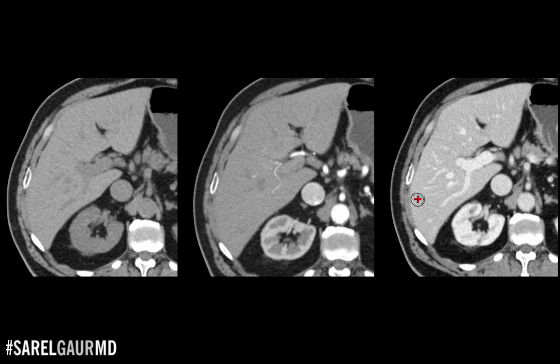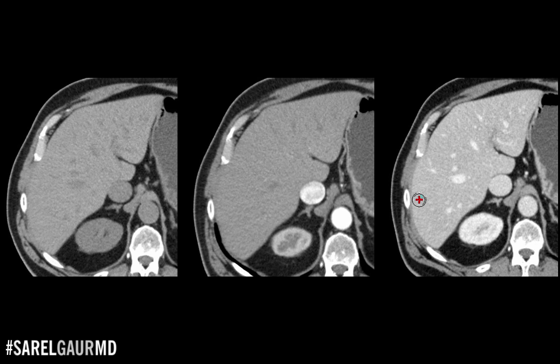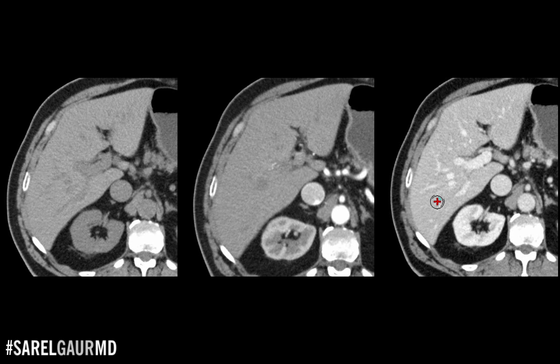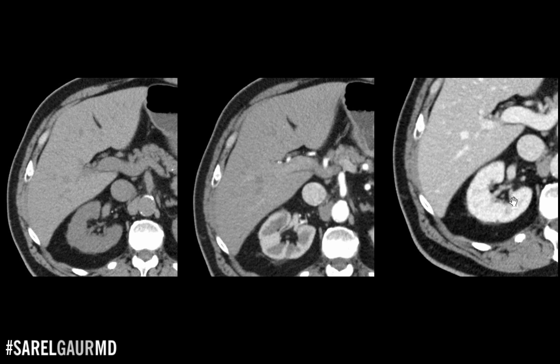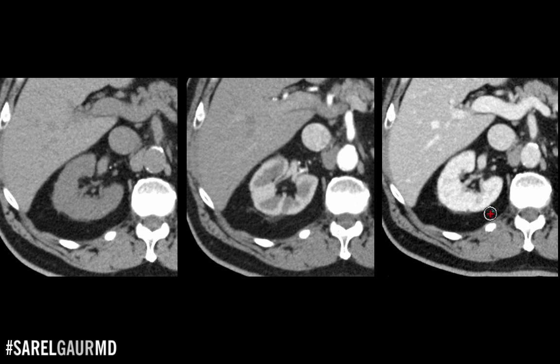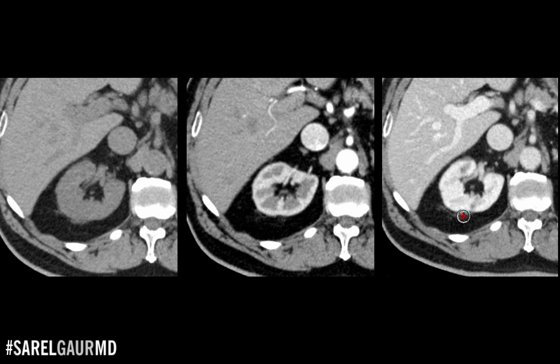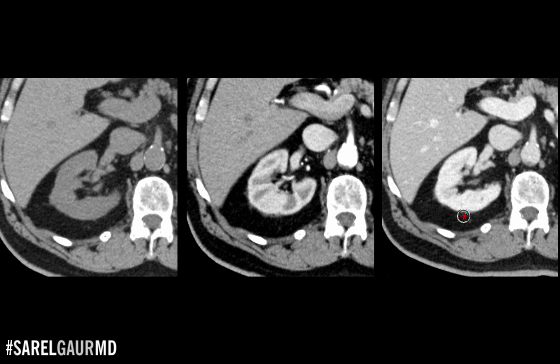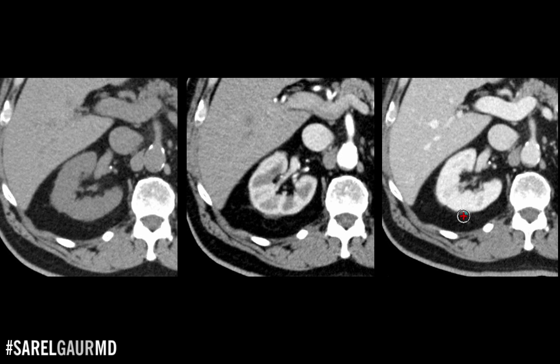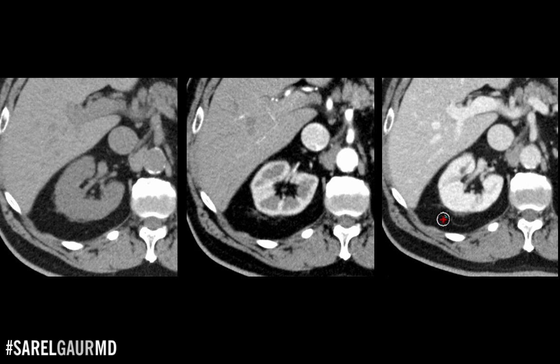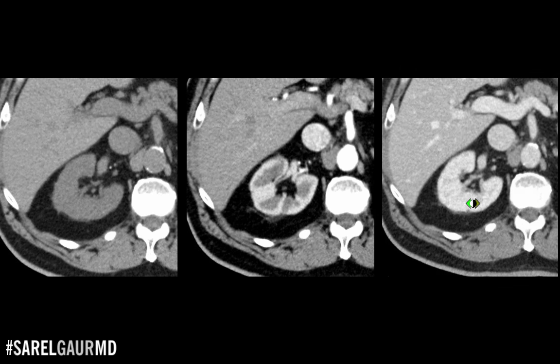This proves that the hepatic arterial supply is non-dominant — a characteristic trait of the liver that we exploit in order to treat liver tumors. Coming back to the kidney: this phase is also considered the nephrographic phase. The kidney parenchyma now has homogenous enhancement with no corticomedullary differentiation, due to the timing of contrast moving from the glomeruli into the tubules. This is a great phase to evaluate the kidney for focal lesions like renal cell carcinoma, renal infarcts, or kidney infection such as pyelonephritis.